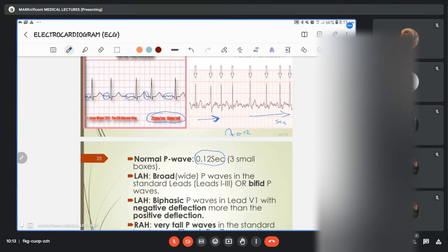So that's what will be suggestive of what you are doing. Let me give you another hint. You can pick two ECG graphs, and then you have one P wave like this, and then you have another P wave like this. Ideally, when you look at this, you just say, okay, this one is wider P wave. But it will be surprising to you that this is actually shorter. Now, what will help you determine that? By the time you check the calibration of that ECG, that would help you determine if it is wider or shorter.